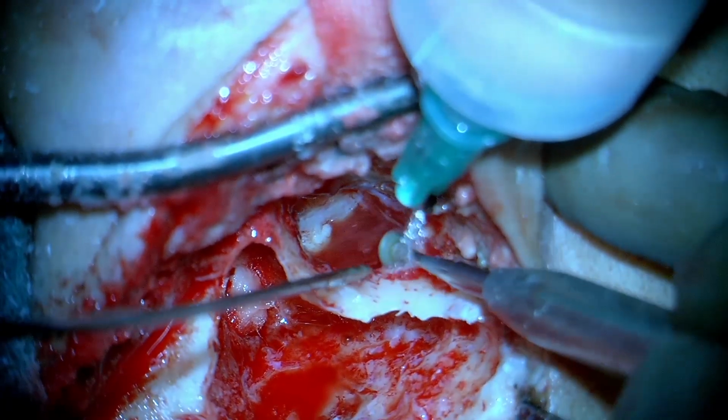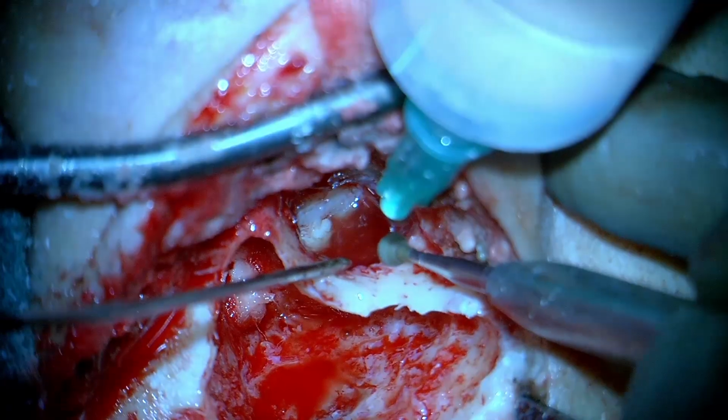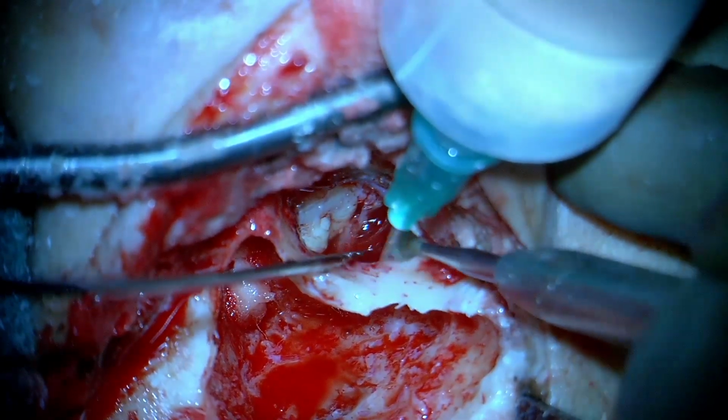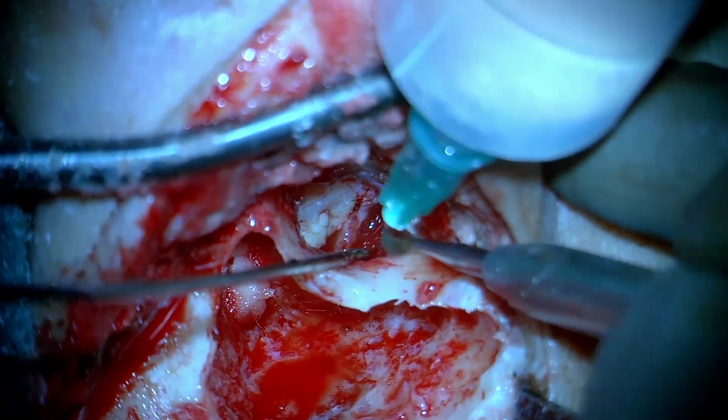So now you see that there are granulations on the external auditory canal anteriorly towards the canal side. We are taking a diamond burr to clear them and to create clean, polished bone on the external canal side.